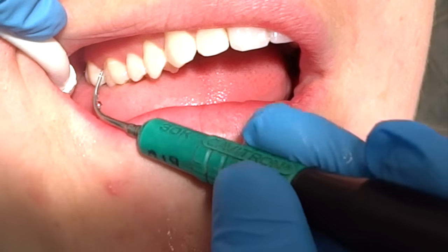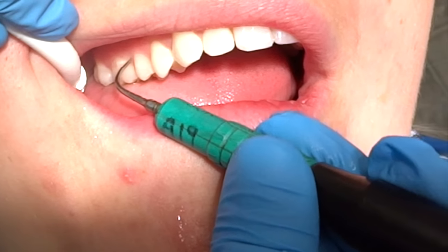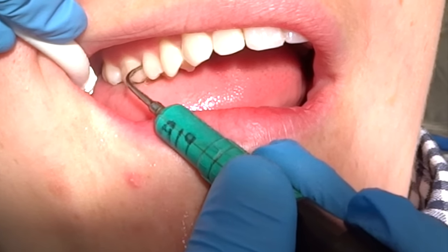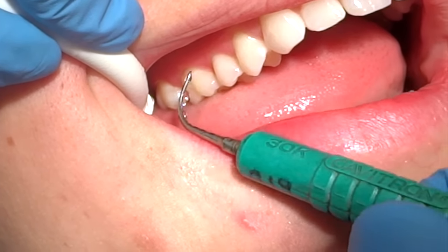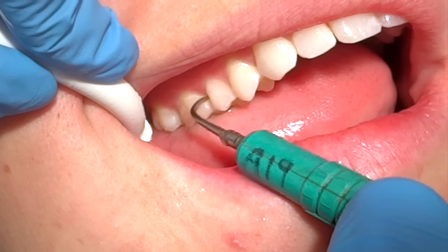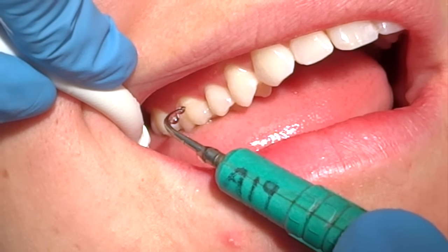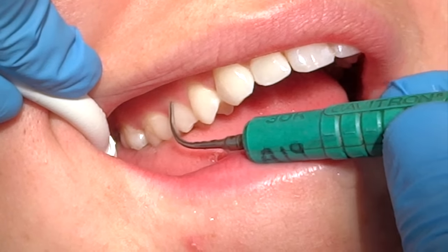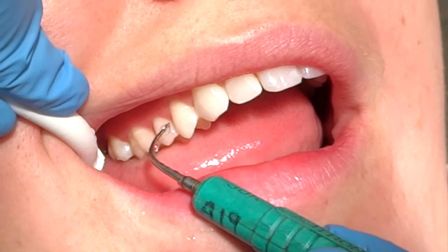Using curette style towards the back, using those lateral sides. Now I'm going to show you what we like to call the Shelly sequence. When you're in the interproximal space, you just bounce down towards the contact and then up towards the distal of the other tooth. You're coming on the mesial of one tooth, staying interproximal, and then going to the distal of the other tooth without moving your instrument out. You go from probe style to curette style, using the lateral side.